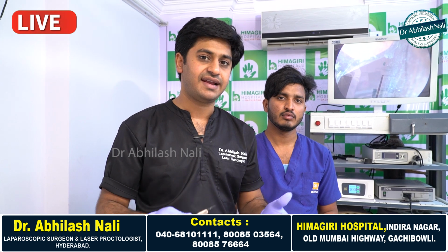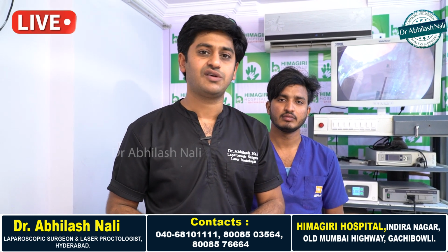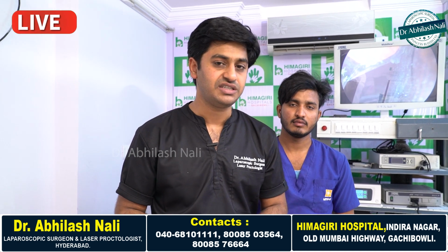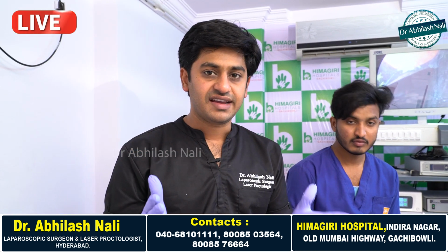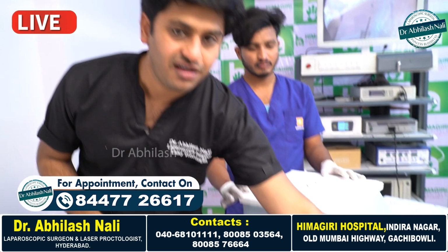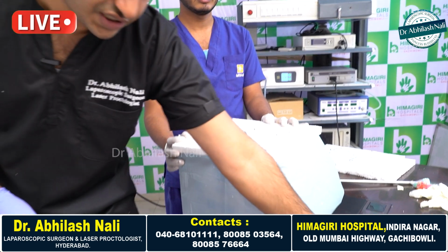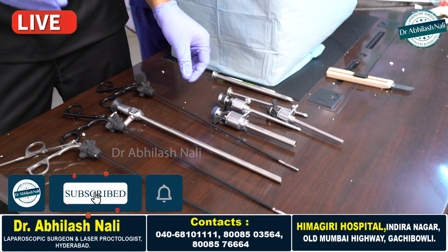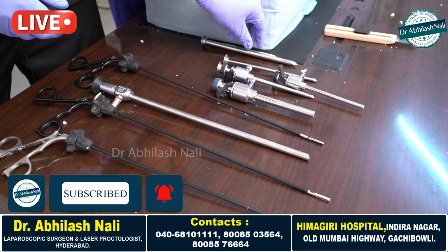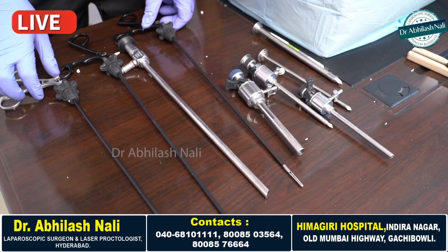But how exactly is a laparoscopic surgery performed, and what are all the advantages of laparoscopic surgery over open surgery? What are all the instruments that are used in laparoscopic surgery? Unlike these knives which are conventionally used in open surgeries, in a laparoscopic surgery we have these, called trocars, and these are the laparoscopic instruments.